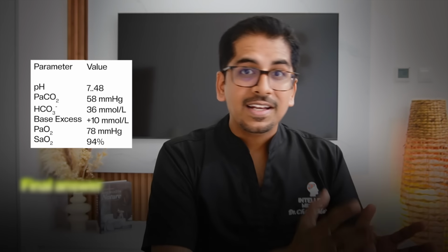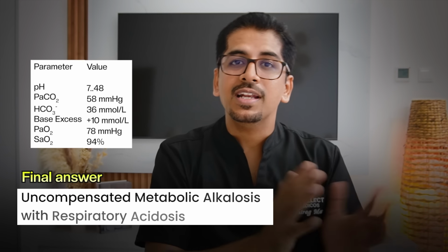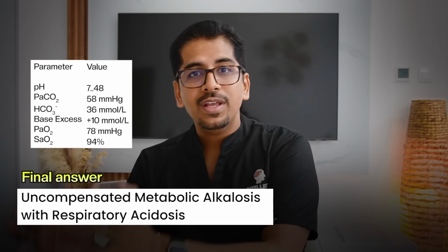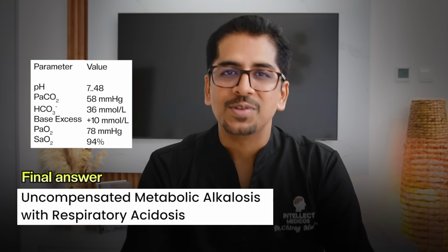So I would just say the final answer for this ABG is uncompensated. Why? Because pH is more than 7.45. So uncompensated metabolic alkalosis with respiratory acidosis. So this is a mixed disorder again.